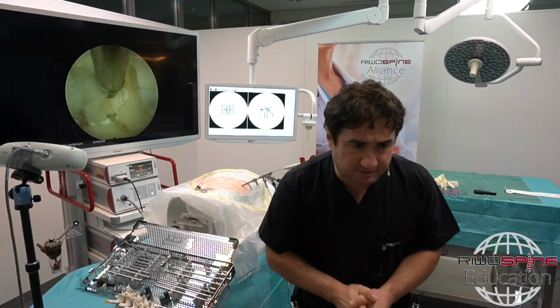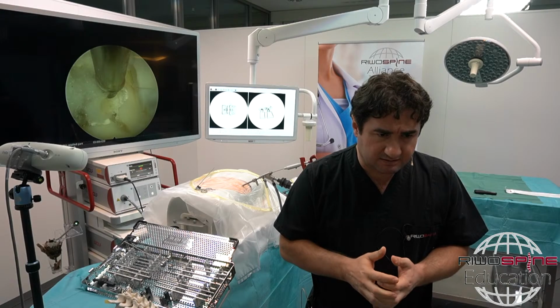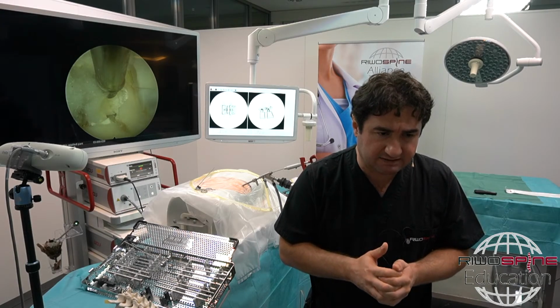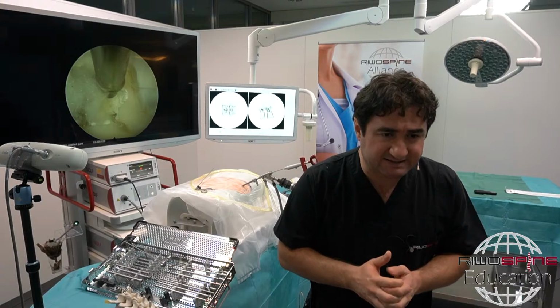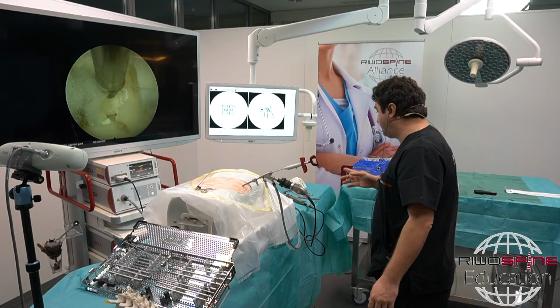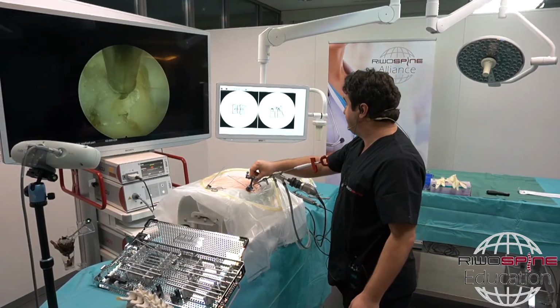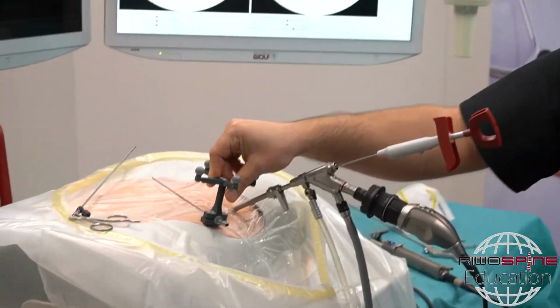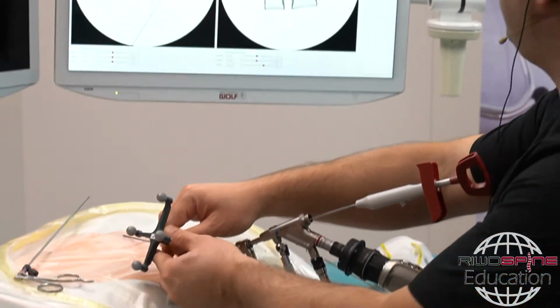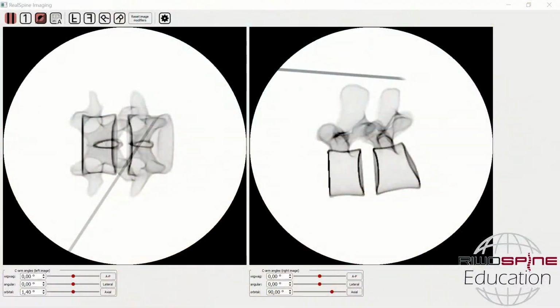Do we have? Yes, and yeah, there is another question that I don't understand very well from Nesma Mahmoud. Oblique craniocaudal or medial? Maybe it is about the direction for the L5S1. Usually for the L5S1, there will be the iliac crest, and maybe can we switch to the Frederick? Can we switch to the yeah? Then usually, if there's an iliac crest, you can choose the direction like that.